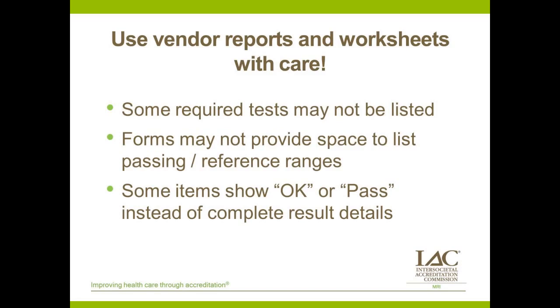So during each quarterly PM, we're going to cover 4 of those items. So you have 1 through 4 the first quarter, 5 through 8 the second quarter, and so on. So if you're looking at a single quarterly report, you will not have a complete listing of all the tests and all the results that are required under the IAC's list of required preventative maintenance items.